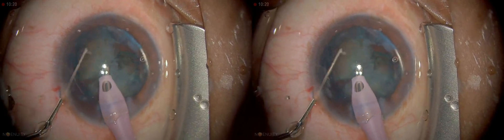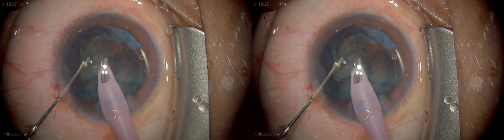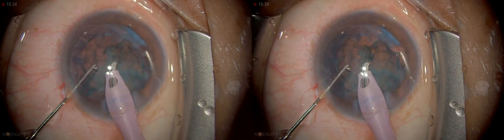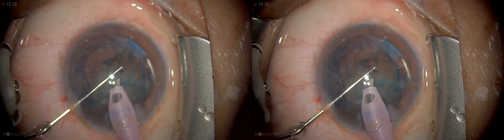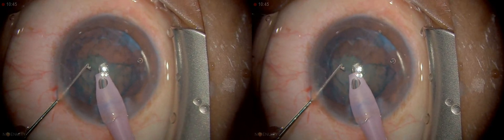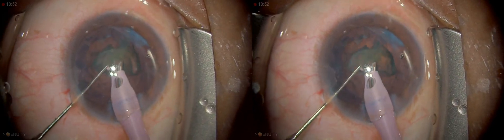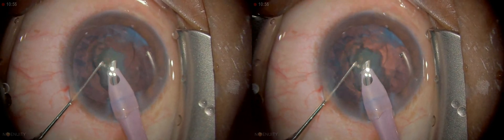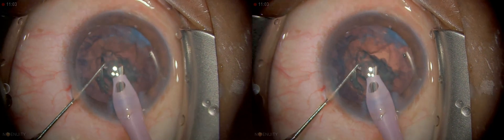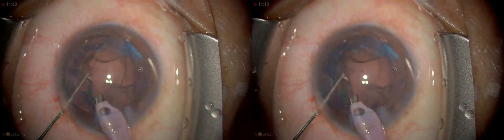You can see that I tumbled it but I'm still controlling it, keeping the sub-incisional quadrant as long as possible. You can go through cases very fast, but patient safety is paramount and each step has to be done very purposefully. It is possible to use very low levels of energy — there are advantages of keeping the cumulative dissipated energy levels low.